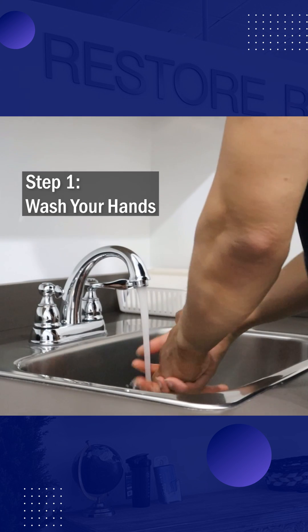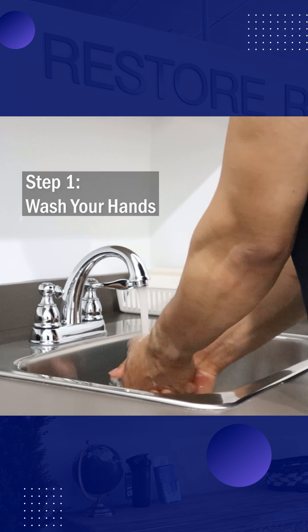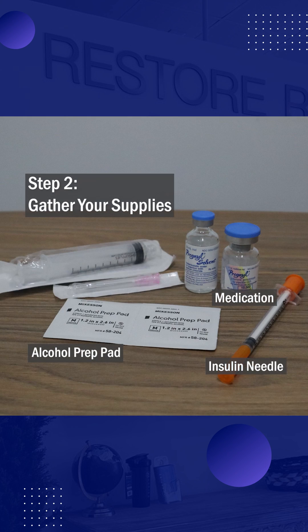First, wash your hands thoroughly. Next, gather all of your supplies. You'll need an insulin needle, alcohol prep pad, and your medication.